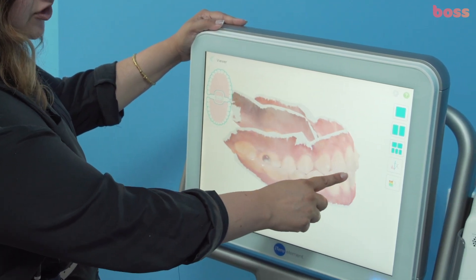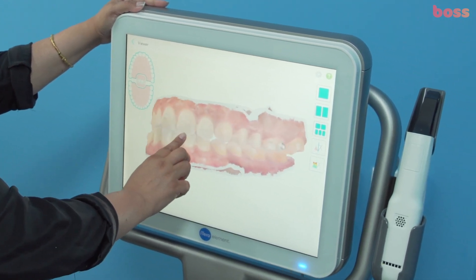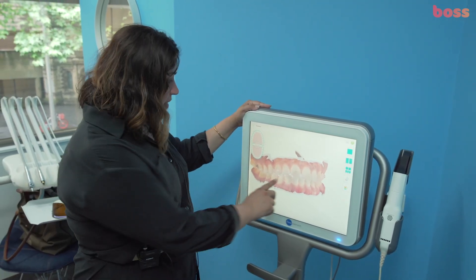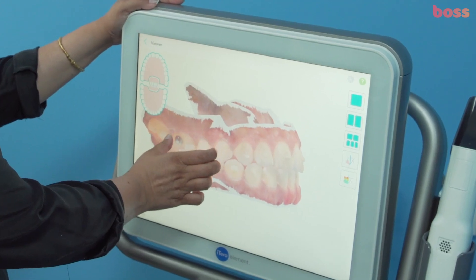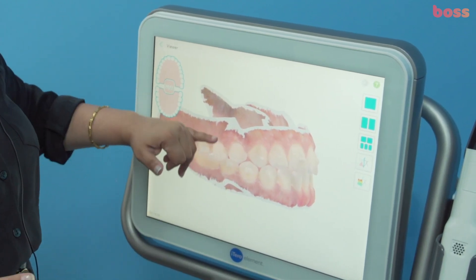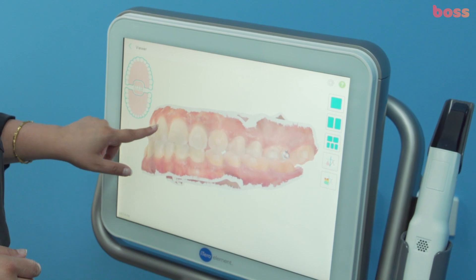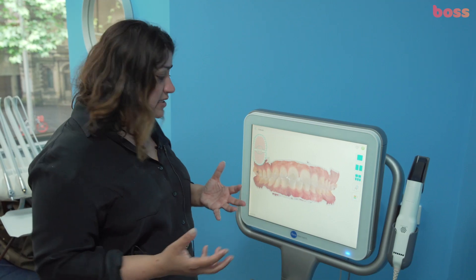What we really wanted to do was improve smile aesthetics, arch symmetry, and provide a bit more incisal display on smiling. We have the correct extrusion attachments in place, and we're going to continue with a bit more extrusion — about another millimeter. As we extrude a millimeter, we'll tell our technician to intrude the upper posteriors by a millimeter as well, because every force has an equal and opposite reaction. We've also asked the patient to wear asymmetric class 3 elastics.